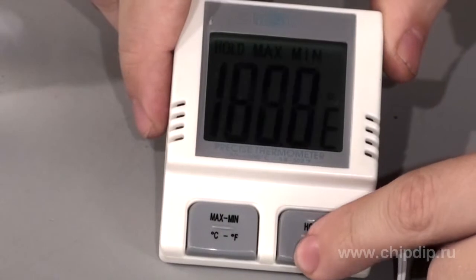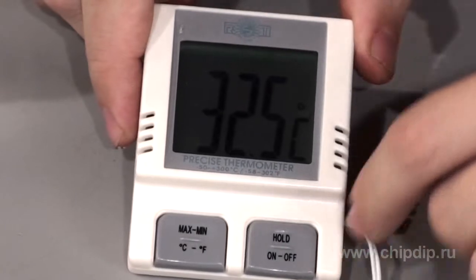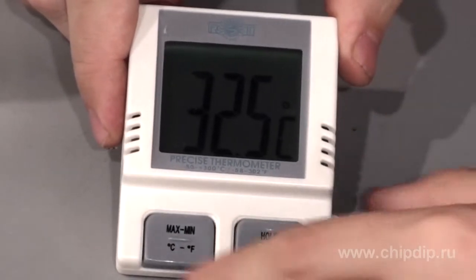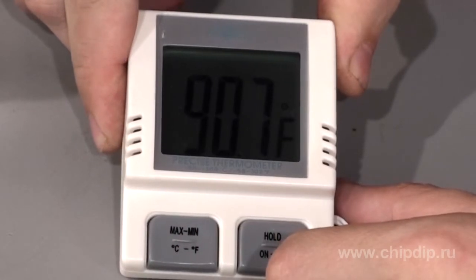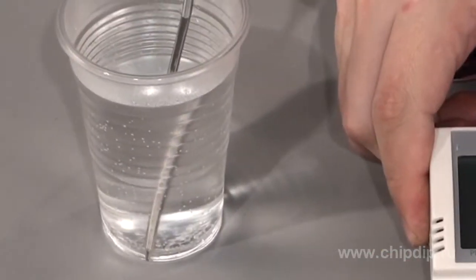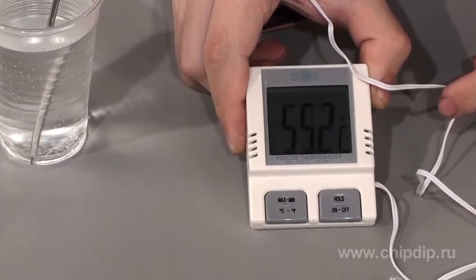This thermometer is very easy to use. To measure temperature, the device is switched on using the ON-OFF button. To change units, press and hold the C/F button for about 4 seconds. Place the end of the probe into the medium where you want to measure the temperature. The result will be displayed in a few seconds.